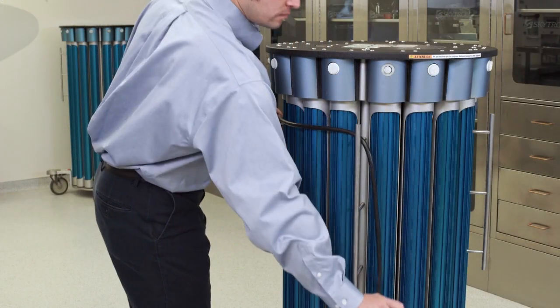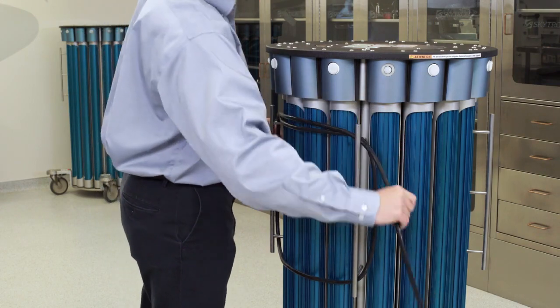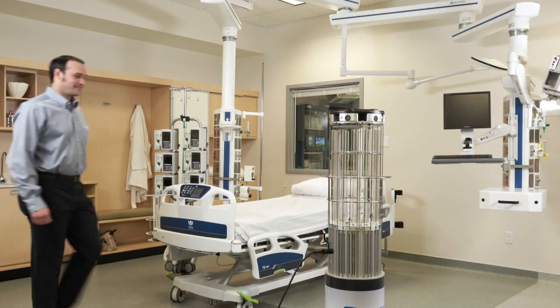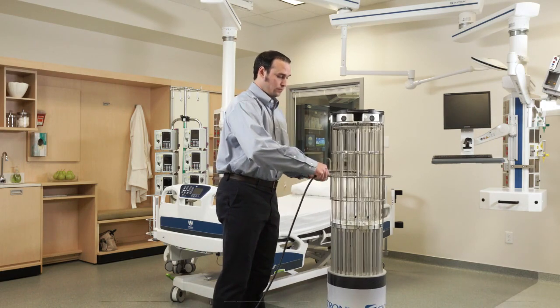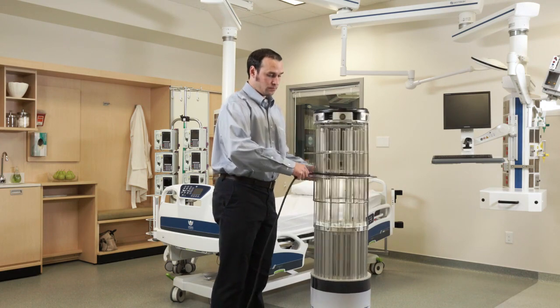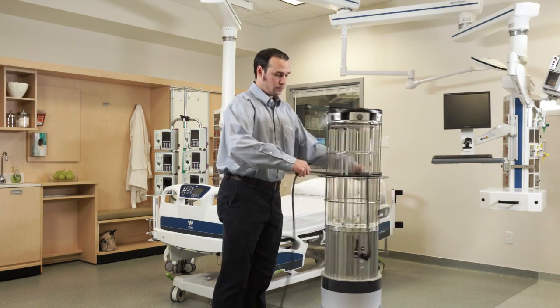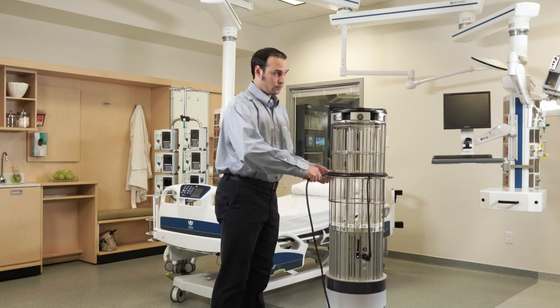To safely stow the power cable on the 3200, wrap the cord around the two handles. On the 1140 model, coil the power cord from the point connected to the machine, not the plug end. This will send the coils outward to the freely spinning end instead of the fixed point on the machine, which will over time become permanently twisted and tight.